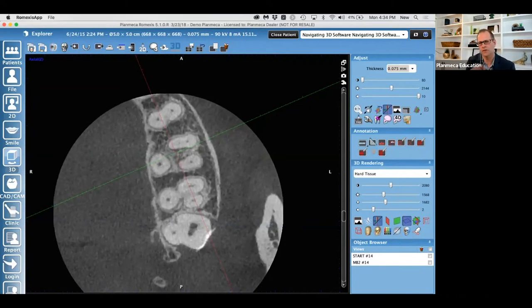The best way I can describe this to you is that everybody in dental school has heard about tomography and its relationship to bread. If we take our loaf of Wonder Bread and we slice it up, that is tomography. That is CT imaging. Medical and dental are just two different ways of creating a book. Dental CT will basically create the book and pull slices from it, and medical CT might do it in reverse. My point is, if I take that image at the highest resolution and take that slice of bread, I can create problems. What problems could happen?